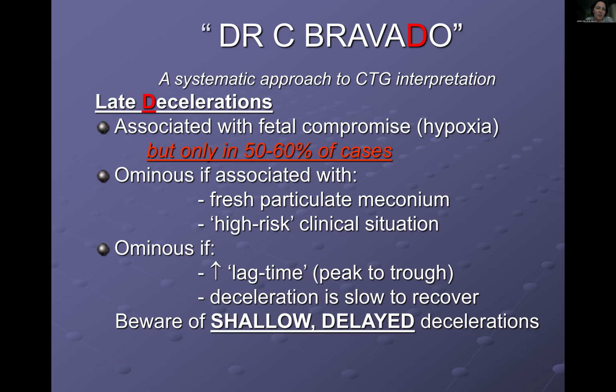Of course, there are situations where, if you have the means, you can do a fetal scalp electrode or fetal scalp blood sampling, if you have access to that, and if the mother is in imminent delivery but hasn't delivered yet, in order to measure the baby's oxygen levels. But if there are no means, or the CTG still looks very abnormal, then you're going to be moving towards delivery in that case.